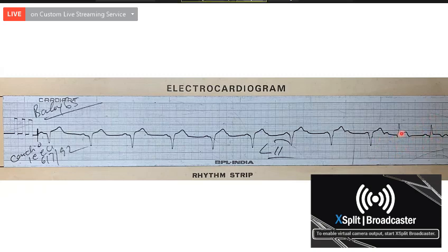And what is seen in the electrocardiogram? ST elevation in lead 2. So what is the diagnosis? Inferior wall. Yes, the patient is having inferior myocardial infarction, transient complete heart block, with an adequate ventricular rate. If you look at the rate, 1, 2, 3, 4, 5, 5.5, almost between 50 and 60 would be the heart rate.